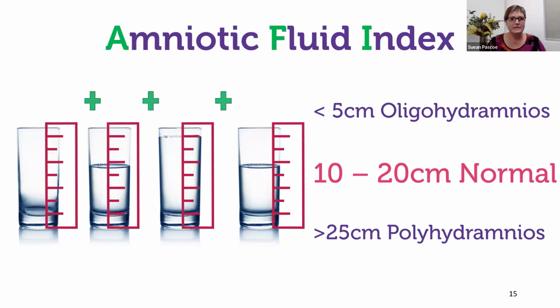Part of my 3rd trimester scan was always just to check the skin line and check that the spine was all intact, because everything's much easier to see. Anyway, I scanned the spine on this baby, and this was the first time that it was discovered she had an 8-centimeter sacrococcygeal teratoma. And one of the things that you can get with that is polyhydramnios. And so when you find oligohydramnios or polyhydramnios, it could be indicative of other things that are going wrong that may not have been so obvious early on in the pregnancy.